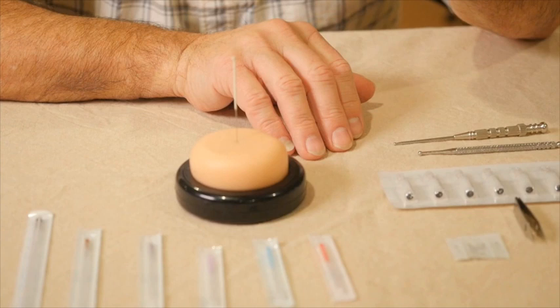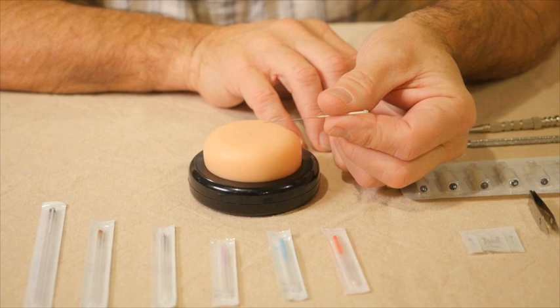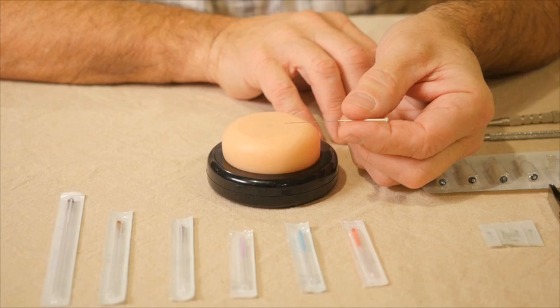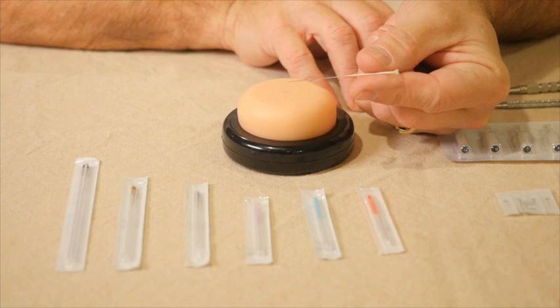However, for many years and still in different countries around the world, reusable needles are used. They need to be cleaned after use, then sterilized, and kept in a sterile condition before being used again. We don't recommend it, and we're not going to be using any reusable needles throughout this course.